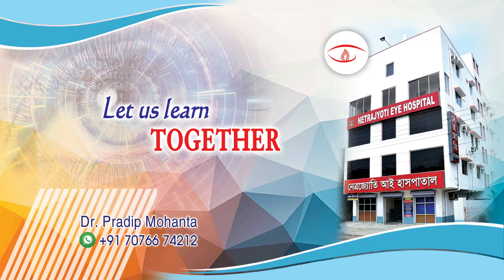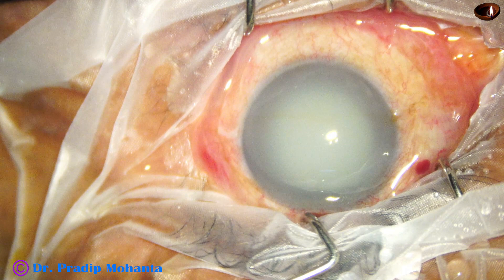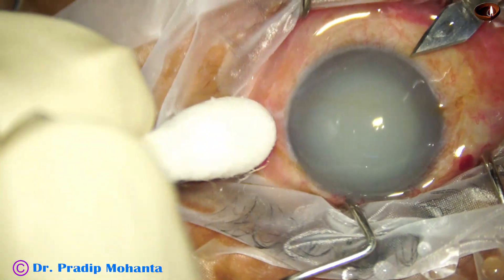Friends, welcome to my workplace at Ranaghat, West Bengal, India. This eye is having phacolytic glaucoma. Let us observe this totally unedited surgery.